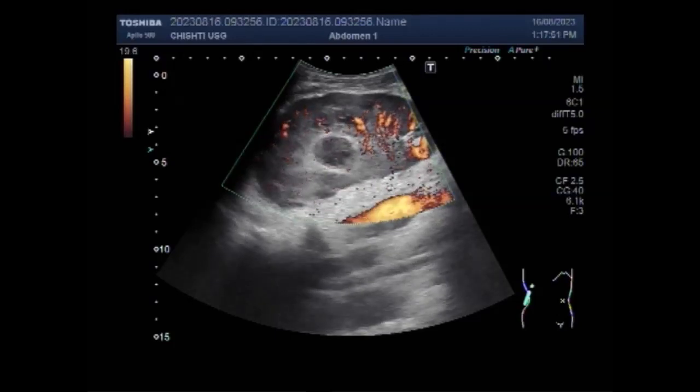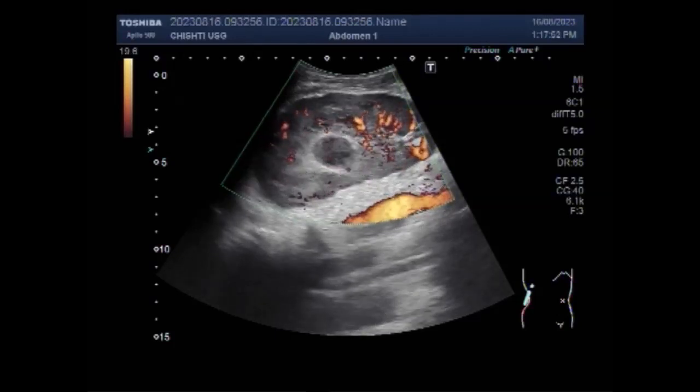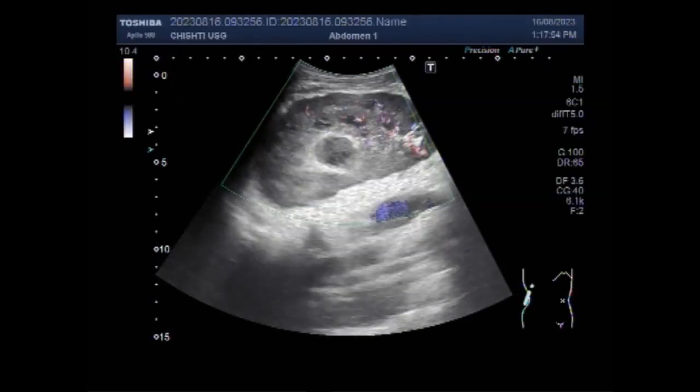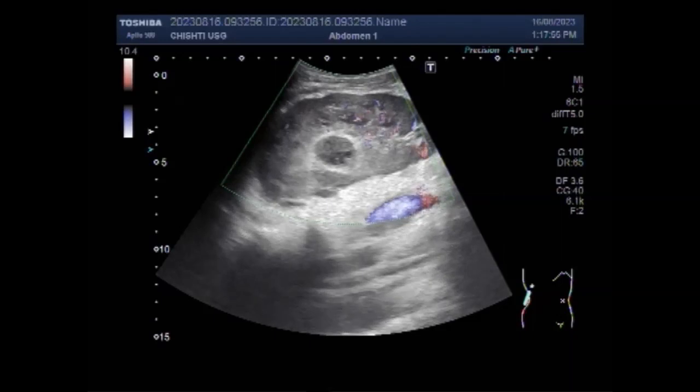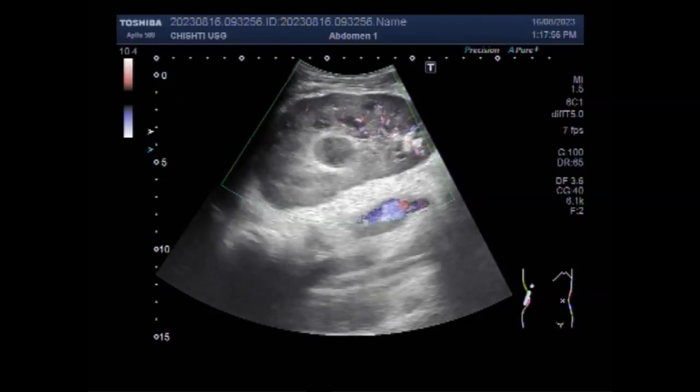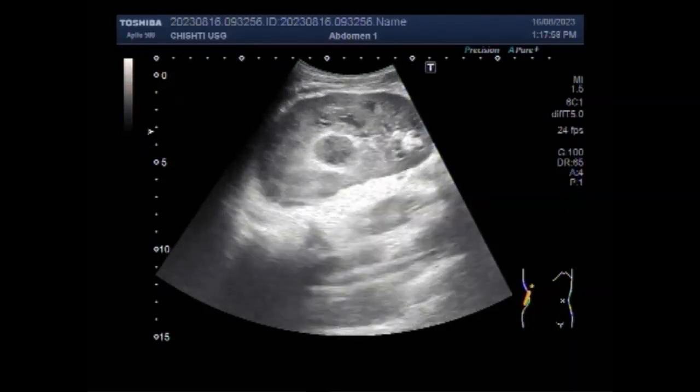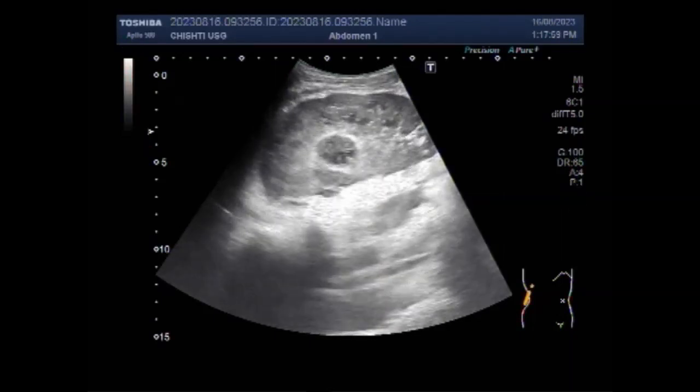You can see that significant blood flow is seen in the kidney, while the blood flow in the mass is not prominent.